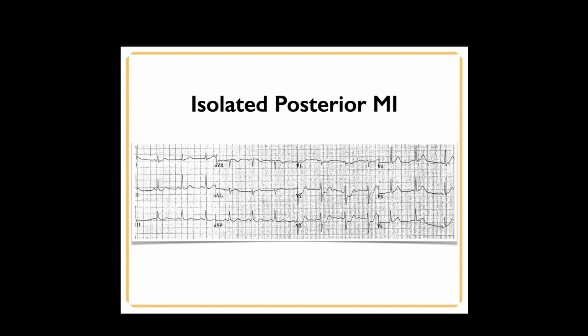Do posterior MIs present the same way as far as patient presentation? Yes, which means all over the map. There's nothing special about the posterior. Is there a certain amount of depression that you're looking for before you pull the trigger to do a posterior? I would say, in this case, at least one box.